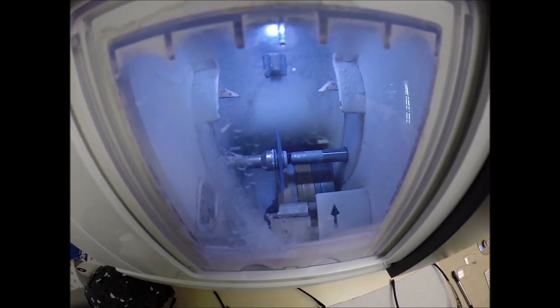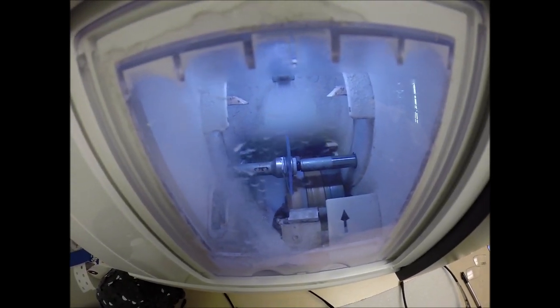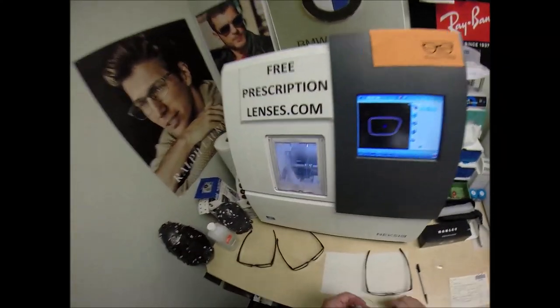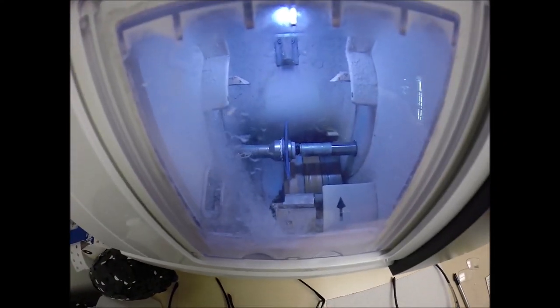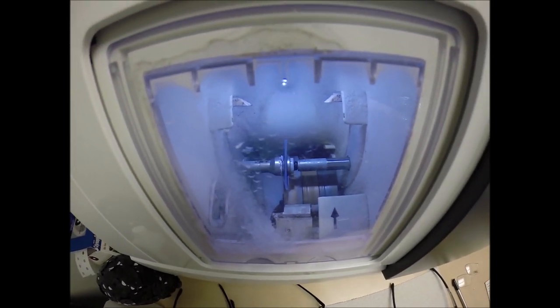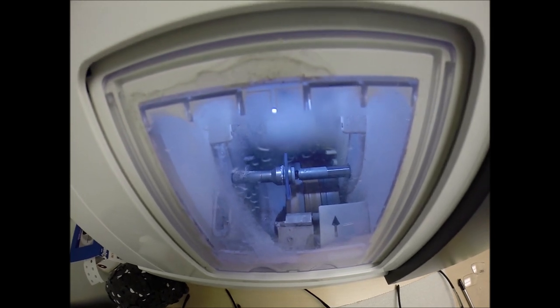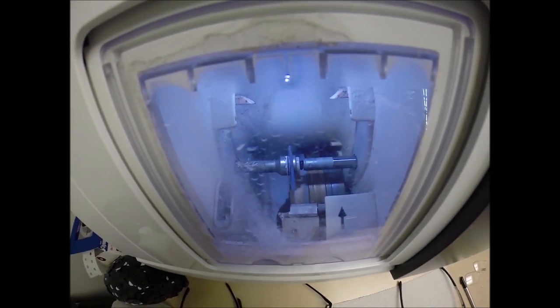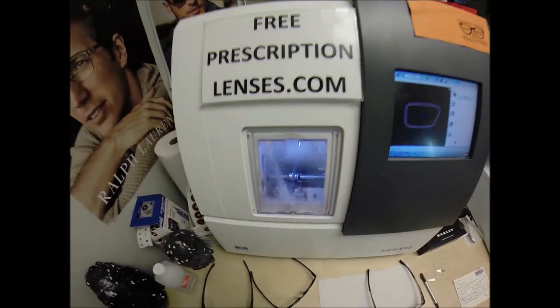With the light flickering in the background, it's water. That's there to actually catch the optical sawdust as it comes off the cutting wheel. Polycarbonate lenses cut dry, meaning that no water sprays onto the lens. However, plastic, high-index plastic, and Trivex, which are different materials, do cut wet, meaning the water sprays onto the lens for the duration of the cutting cycle. Now, water will spray onto your lens, but only for the last 20 seconds.